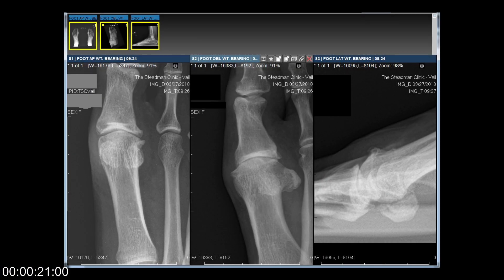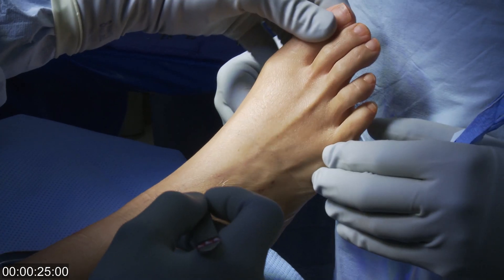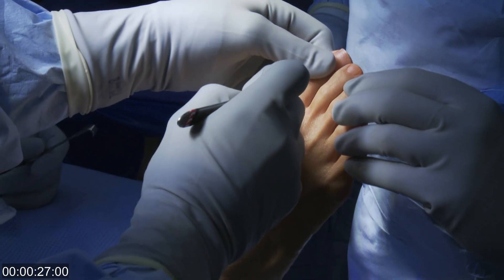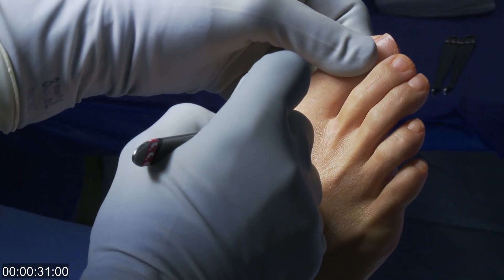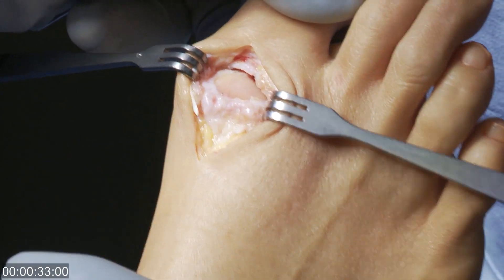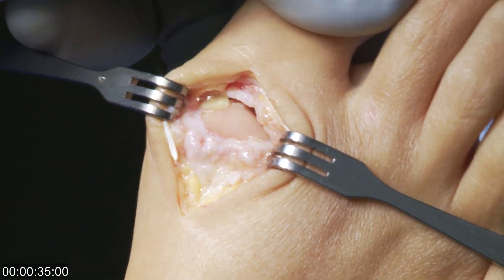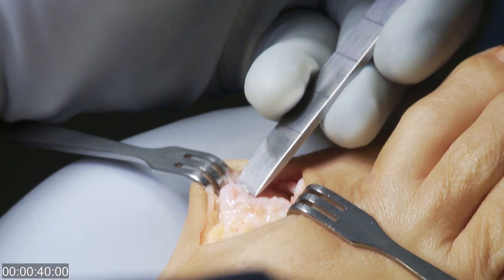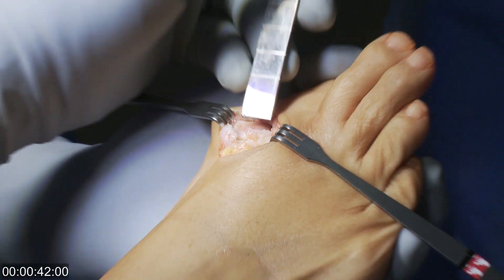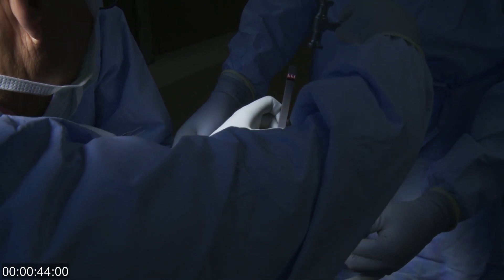These are the x-rays of a big toe joint on the right foot that is arthritic. We will now show the operative procedure for treating this with the Carteva synthetic cartilage implant. You can see that there's no cartilage on the metatarsal head or the base of the proximal phalanx, but there are bone spurs at the top of the first metatarsal.